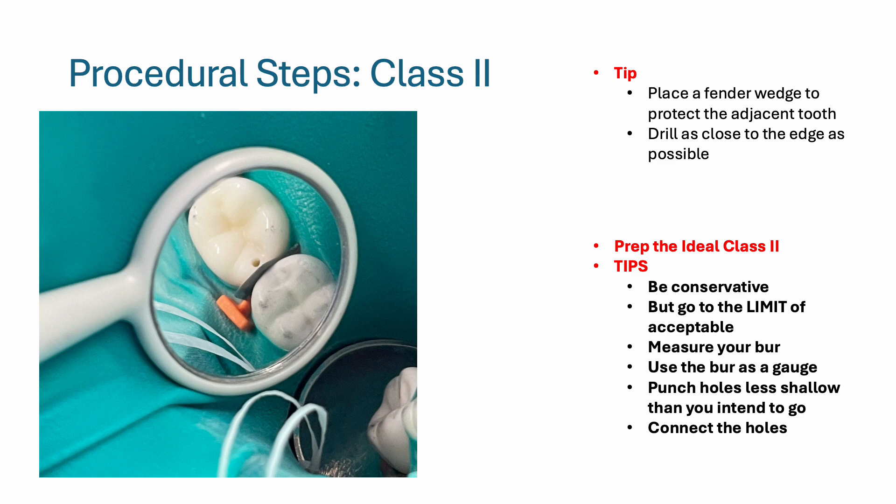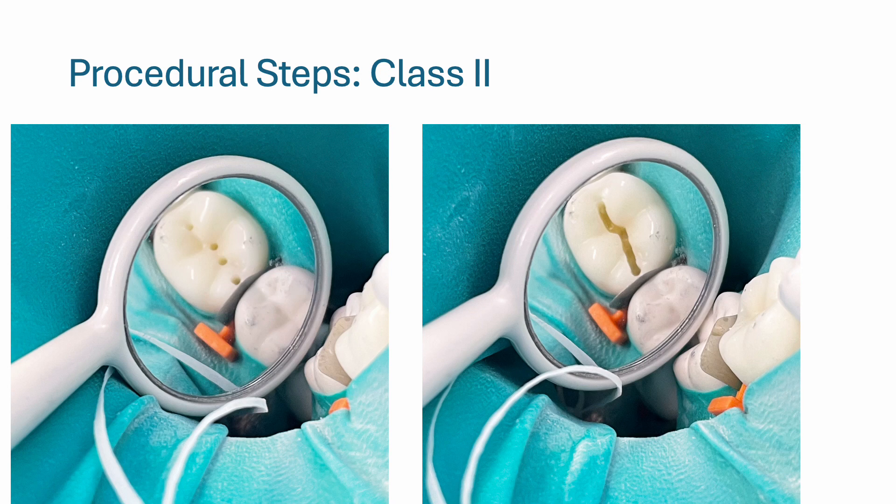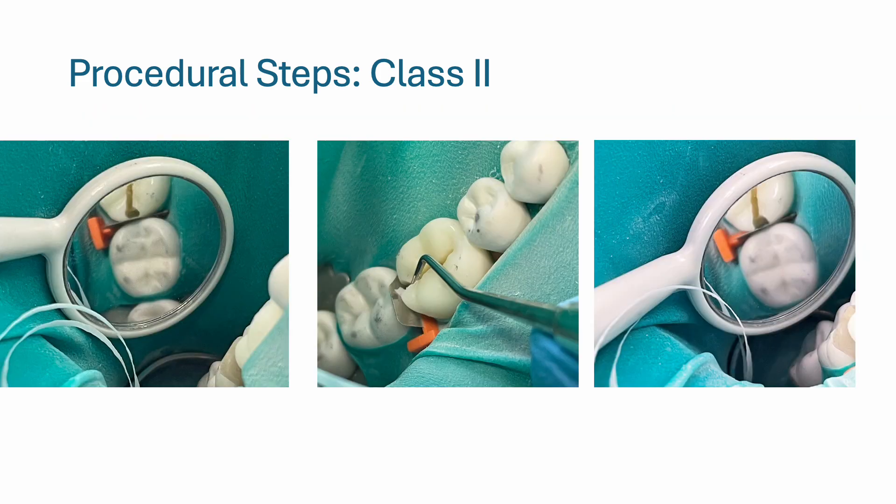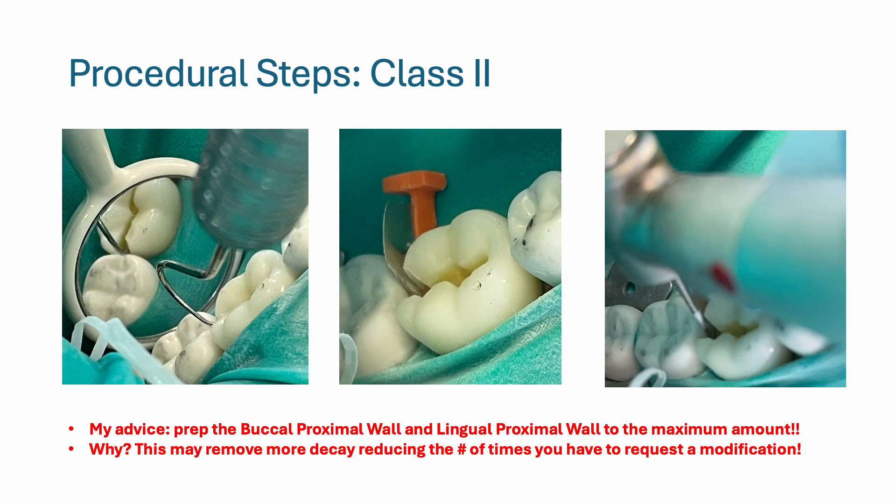Punch holes that are less shallow than you intend to go, because when you connect the holes you'll end up drilling a little deeper. You can always drill deeper later. I recommend first punching one-millimeter holes along the occlusal and three millimeters right next to the fender wedge. Use your perio probe to measure. I left a paper-thin shell of enamel on the distal, then used a spoon excavator to break it to avoid nicking the adjacent tooth. Once you break contact, I recommend using a flame-end diamond bur to refine the buccal proximal wall and lingual proximal wall.